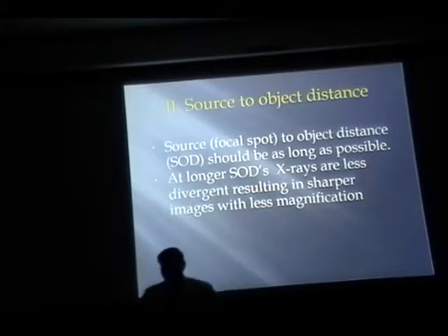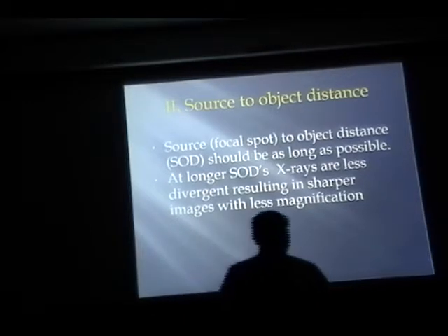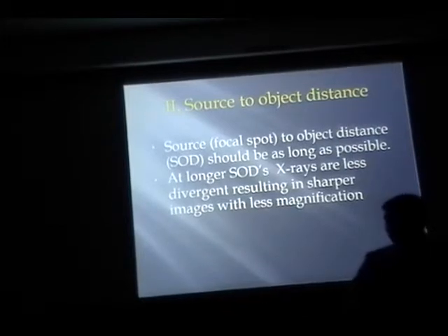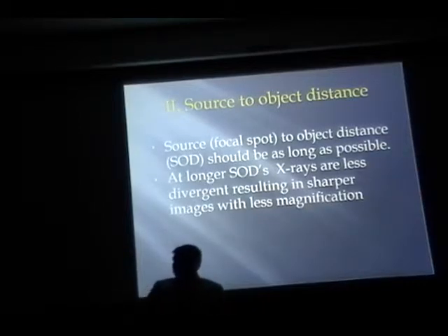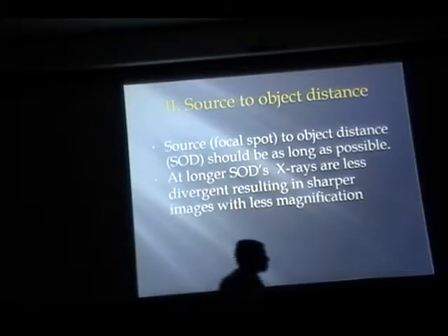So remember I gave you an analogy, right? The traffic in India versus US. Remember? Or you forgot? So going in a haphazard direction. That's what is going to happen if you have a shorter cone or shorter distance. So if it's longer, you're streamlining or telling the X-rays to go in a straight fashion. Okay.